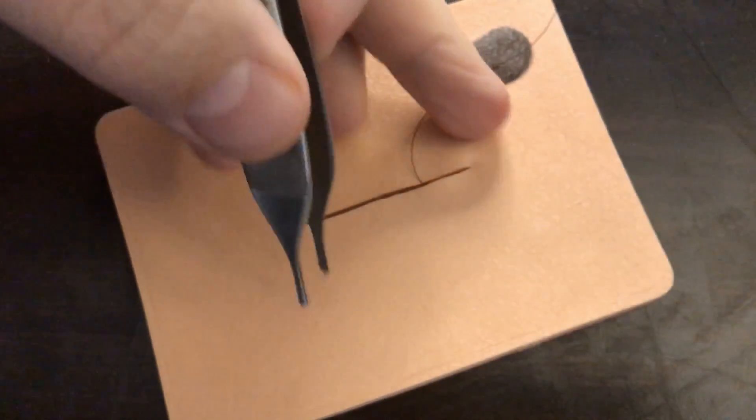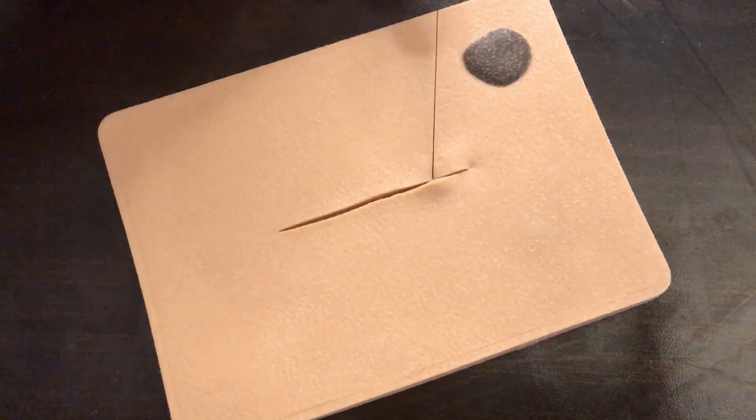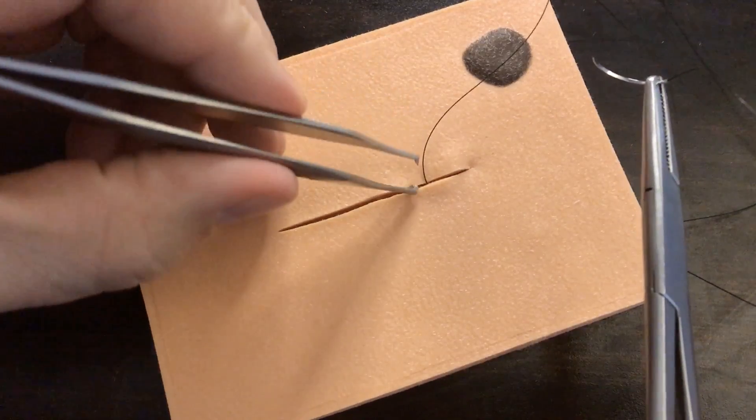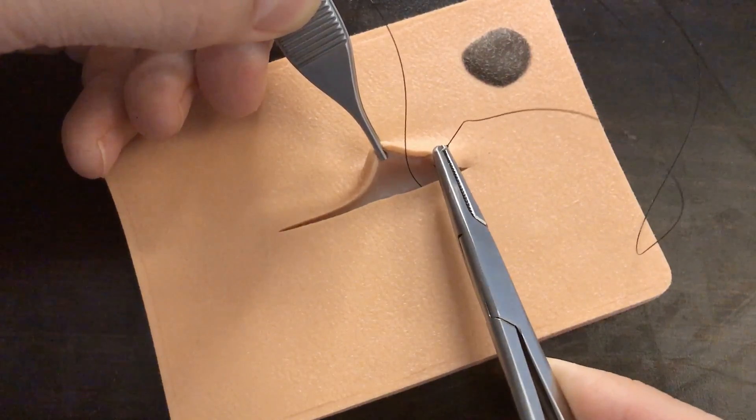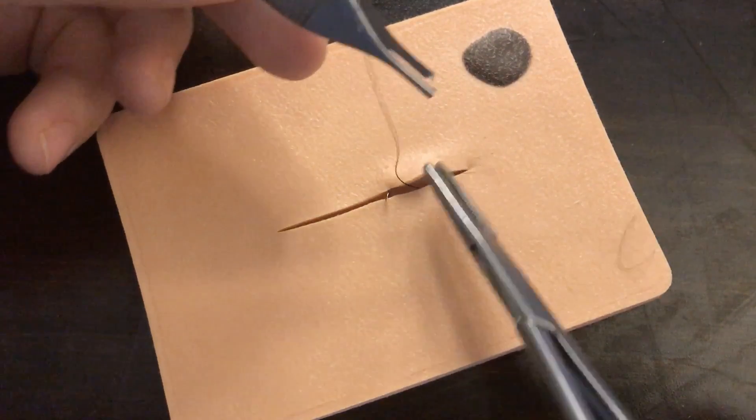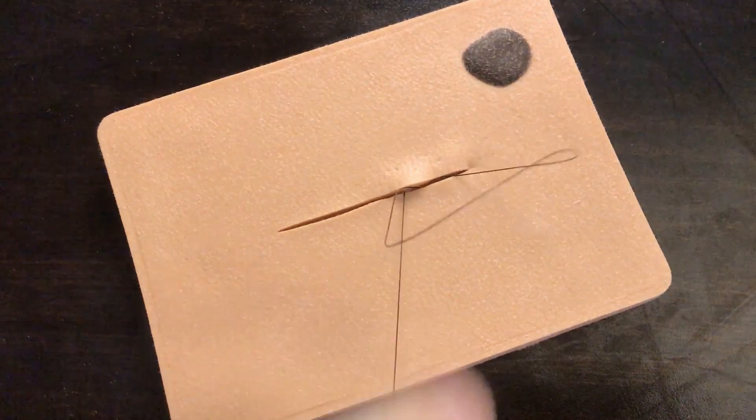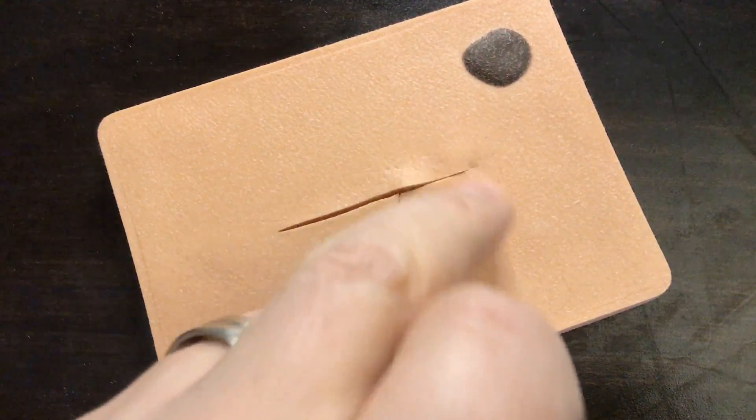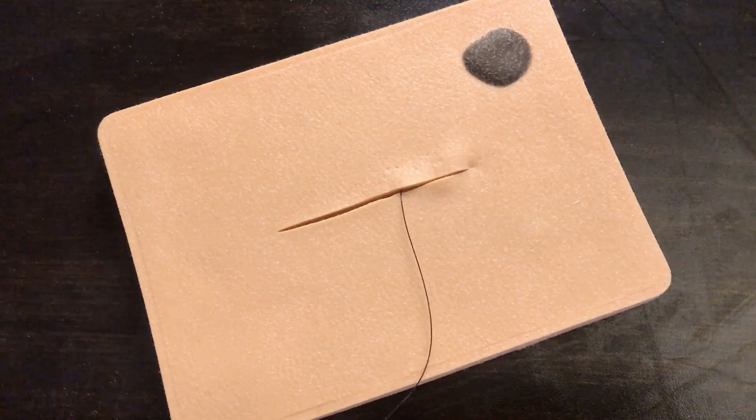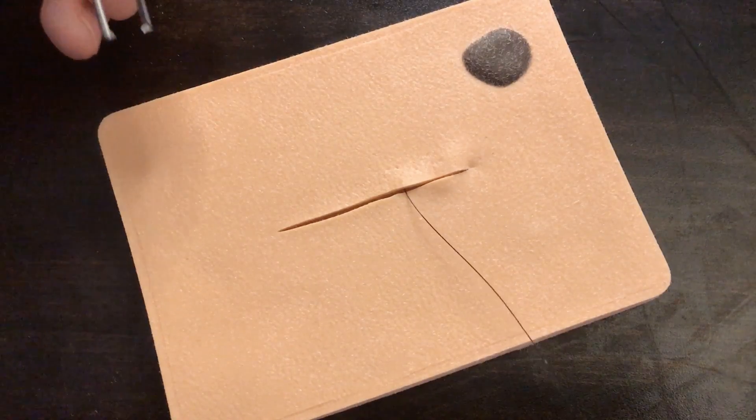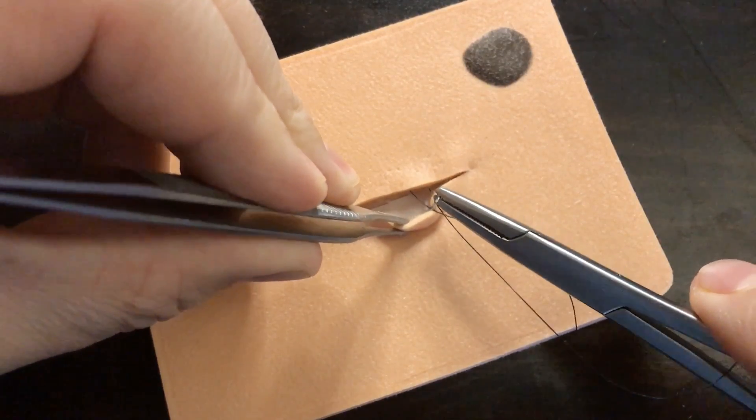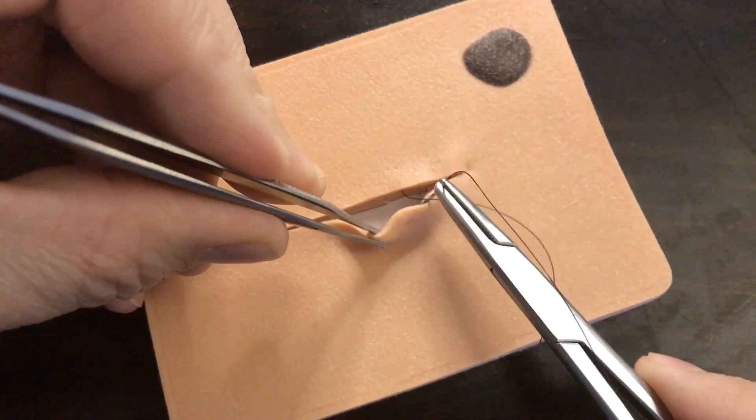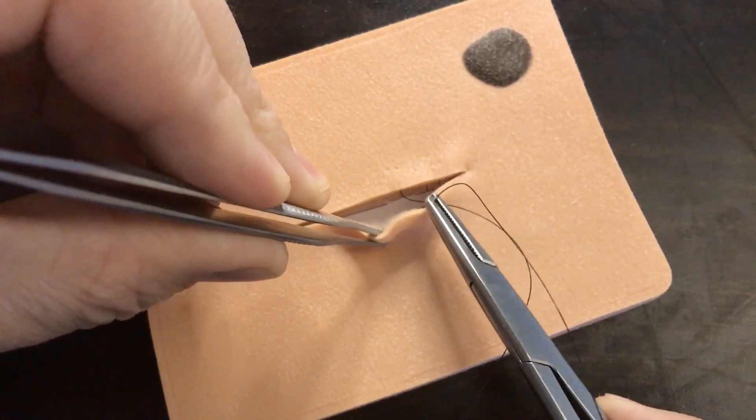And so what we're doing here is creating this S like pattern, staying in the same exact depth the whole way. So that as we go back and forth, it lays flat, the skin edges don't come one over the top of the other one, and we've got a nice closure on the skin level. As you can see, I went kind of straight across and making sure I'm at the same depth. So now I'm getting the skin edges to just kiss there gently and making sure that we've got a good closure. Coming back the other direction again, making sure I'm coming straight across and at that same depth, just superficial, just below the surface of the skin.